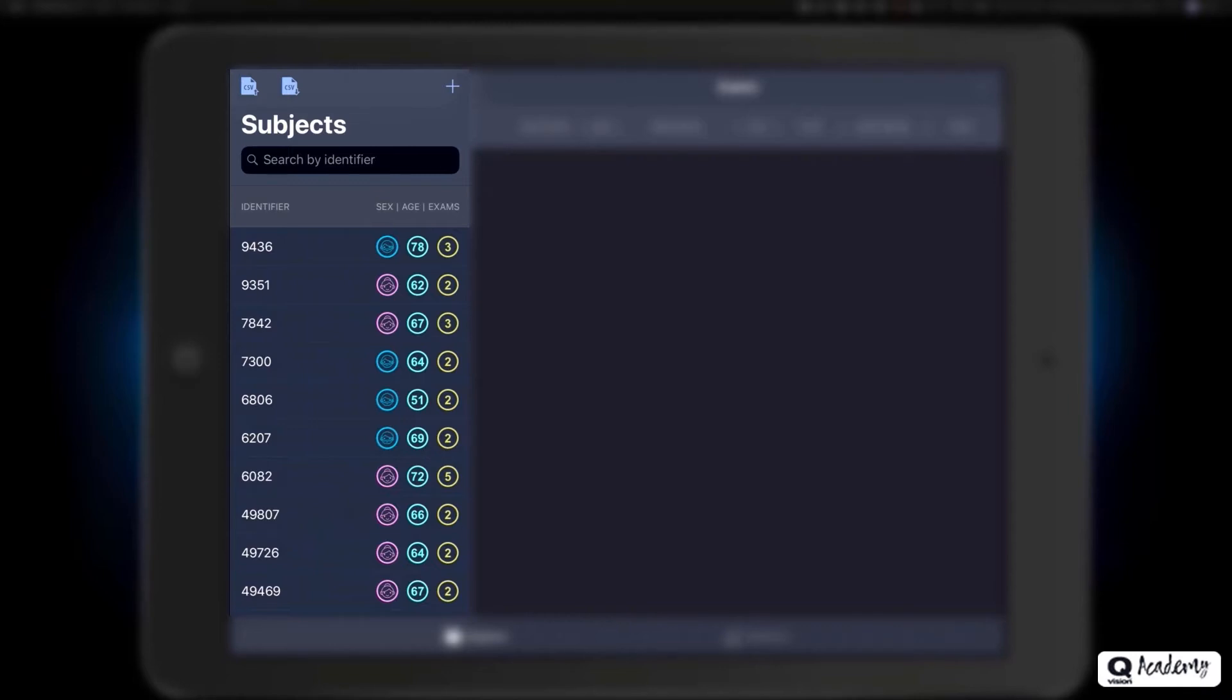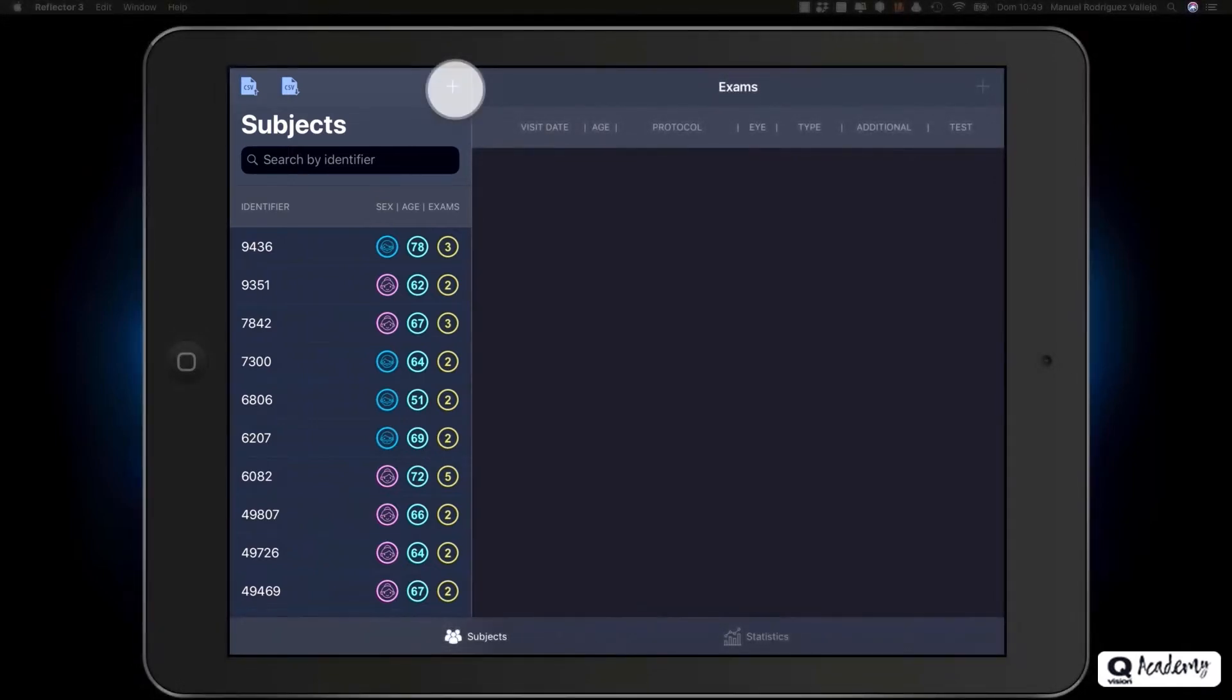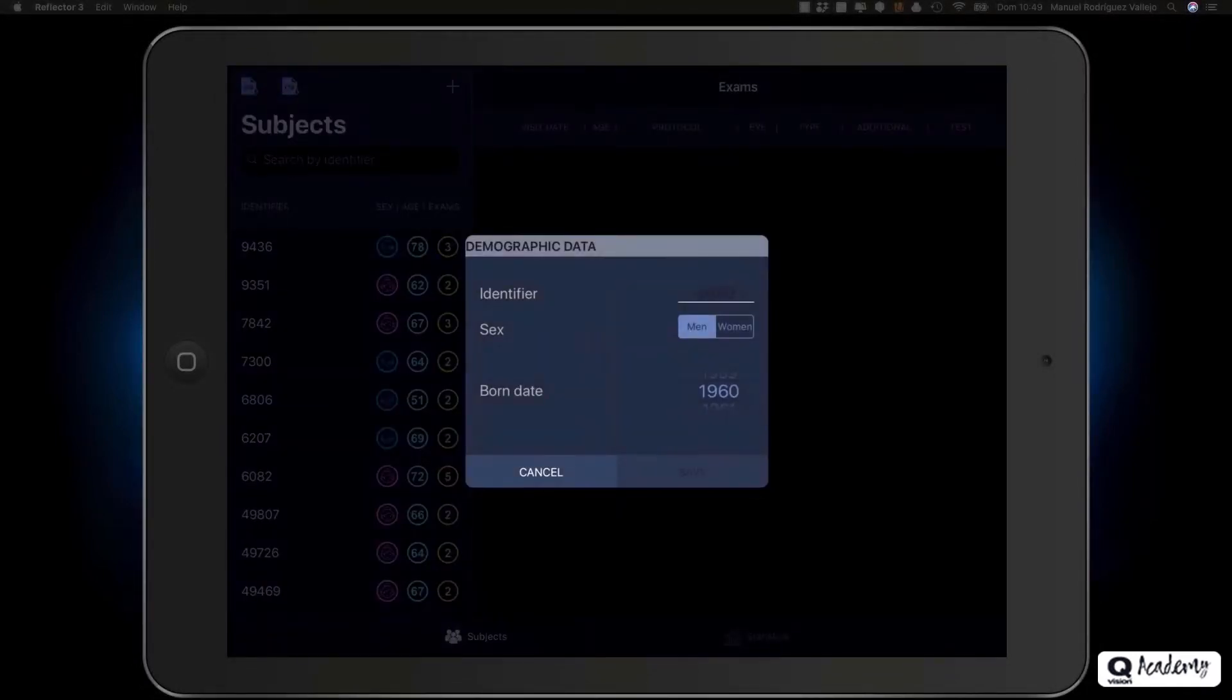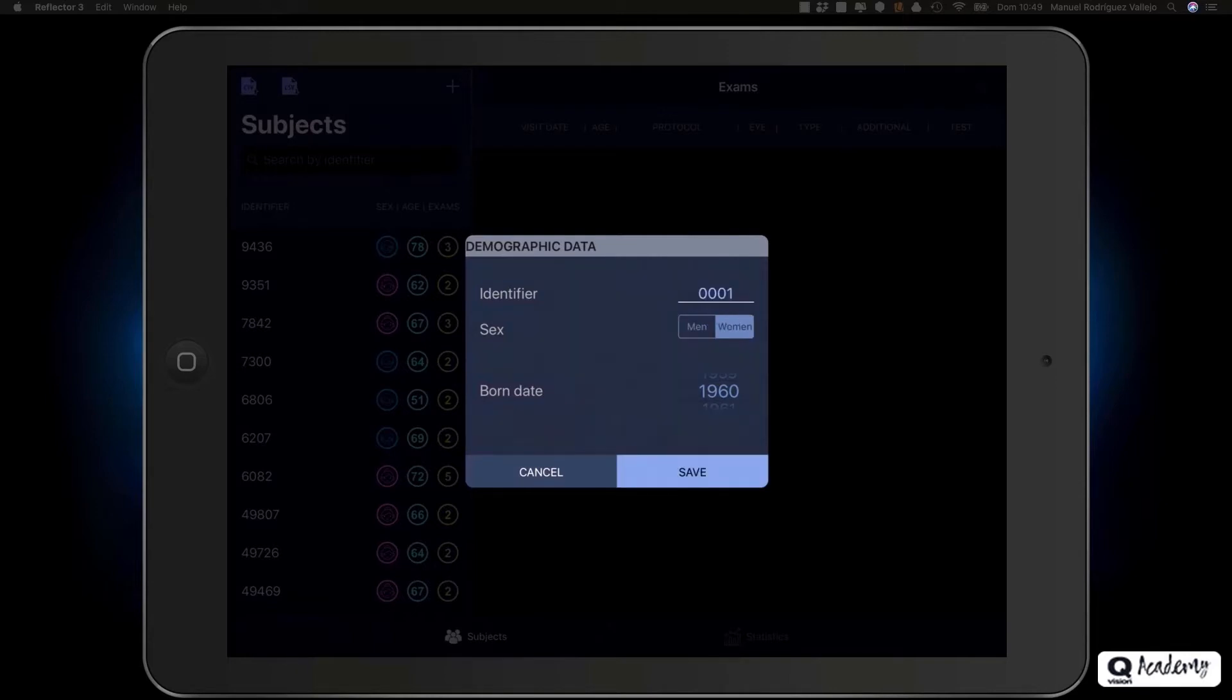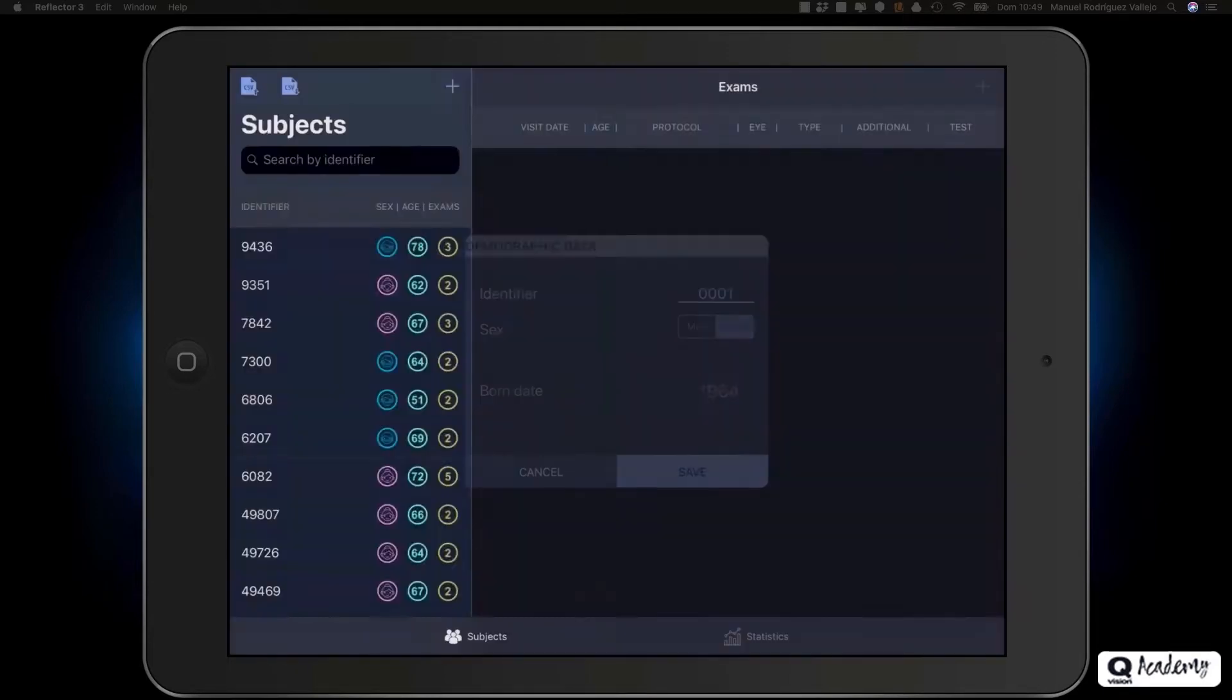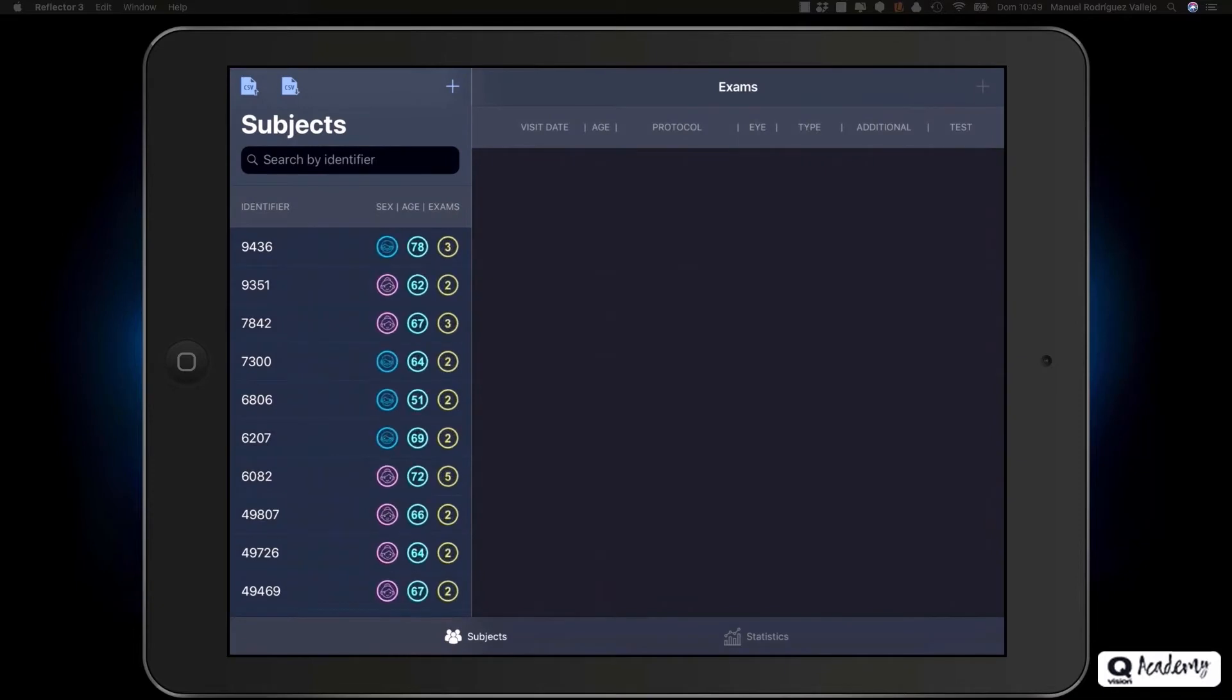To create a new subject, click on the plus button at the top right. In the demographic data window, you will need to insert a unique numeric pseudo-identifier for each patient, the gender, and the year of birth. After clicking on save, you have created your first subject.